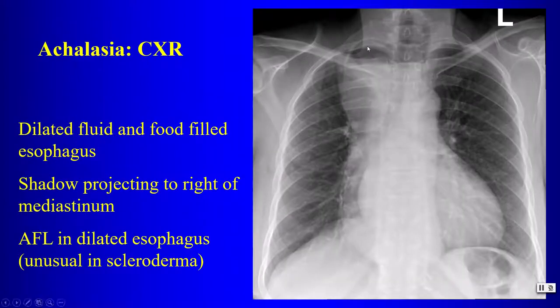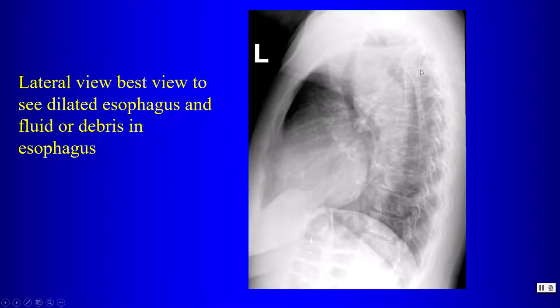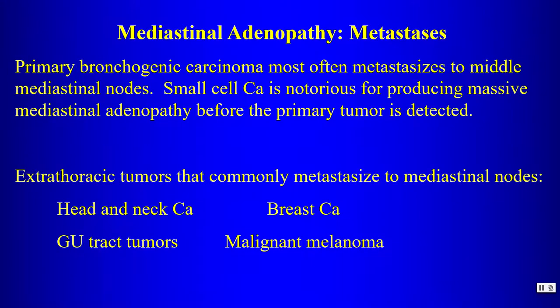On chest radiograph, achalasia presents as a large mass extending down, often flopping to the right so the right heart border appears medial to the opacity. The lateral view is key — it shows anterior tracheal deviation and an air-fluid level, with the mass extending along the esophageal course to the gastroesophageal junction. We should not miss this characteristic appearance.